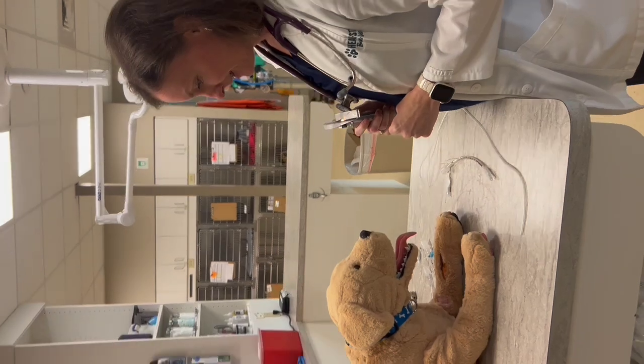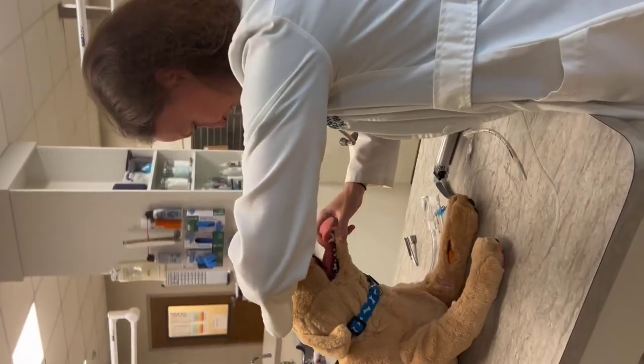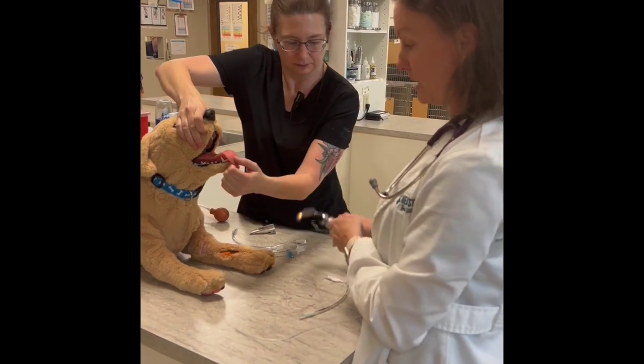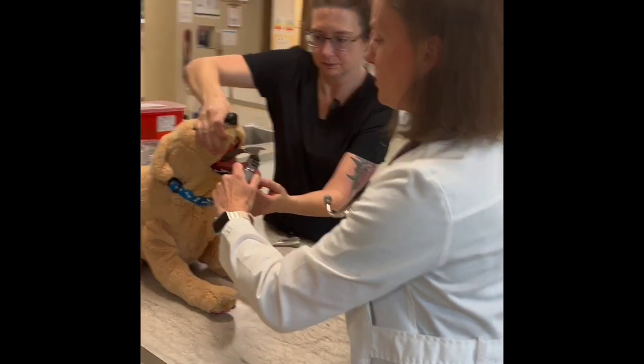Next you need an assistant to hold them. Our assistant is going to hold the dog sternal with the head straight so we can see in there, and she's going to pull out the tongue for me too, because that makes it easier to use the laryngoscope. Then you place the laryngoscope.